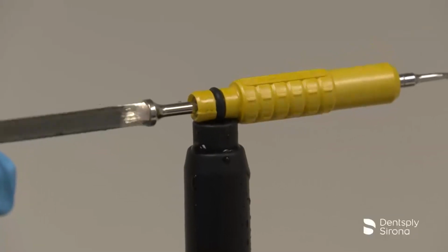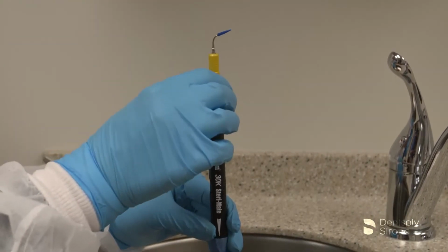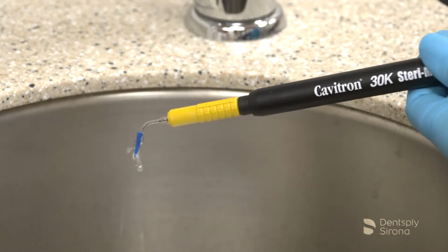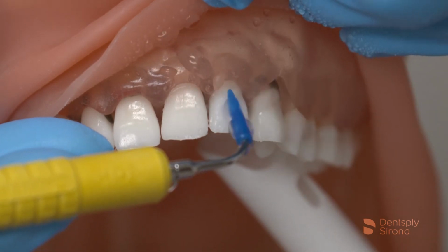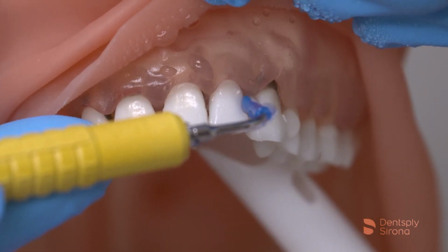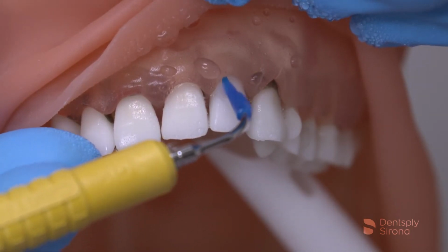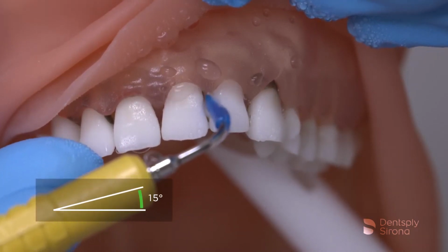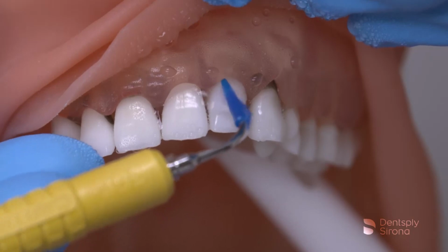After the clinician has placed the soft tip disposable prophy tip with the wrench included, filled the handpiece with water, seated the insert, selected the power, and adjusted the water flow to obtain a fine spray, instrumentation begins according to the treatment plan prescribed for the patient. Dental implants and their titanium surface need additional consideration when choosing the proper debridement instrument. The sulcular environment and the mucosal seal is more fragile than the normal tooth, and this requires a gentle approach and care when debriding in the sulcus. The insert terminal end is placed slightly subgingivally with a 0 to 15 degree angulation and 2 to 3 millimeter adaptation. Utilizing a 1 to 2 millimeter overlapping stroke will ensure thorough biofilm debridement.